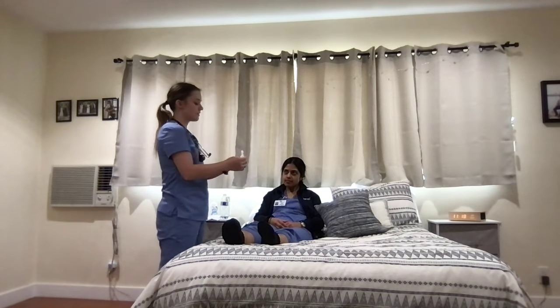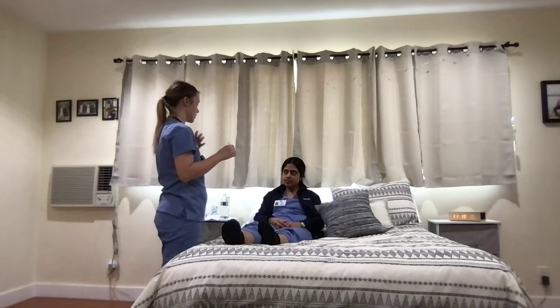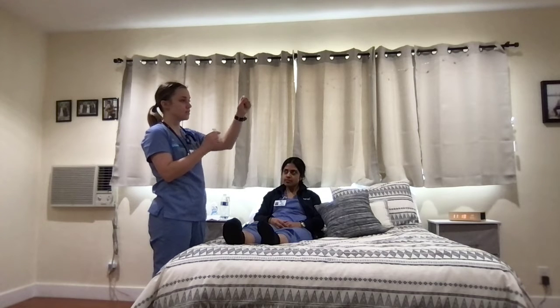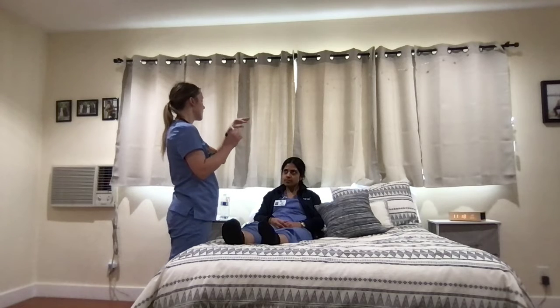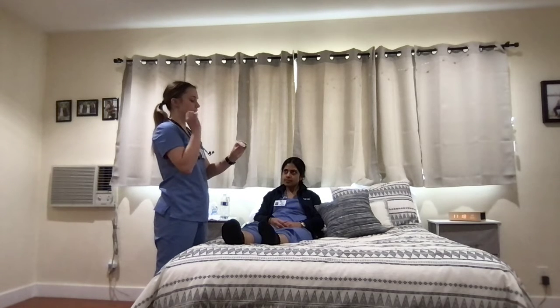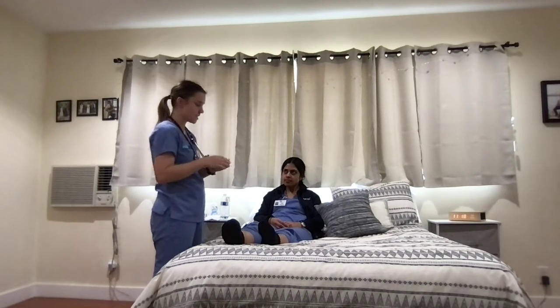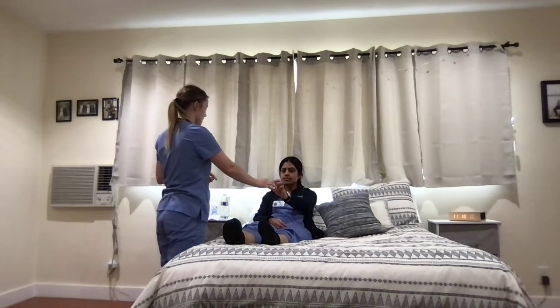So this is the mouthpiece of the incentive spirometer. Your lips are going to go around the mouthpiece. You're going to exhale and then inhale as if you're inhaling through a straw. As you inhale, there's a little ball that's in the incentive spirometer, and it's going to move up, and you're going to inhale until you reach a specific volume that myself, the respiratory therapist, or the provider gives the patient. So you're going to inhale, reach that specific volume, and then hold it for 5 seconds. And then after 5 seconds, you'll just exhale normally. Okay? So I'm going to have you try.